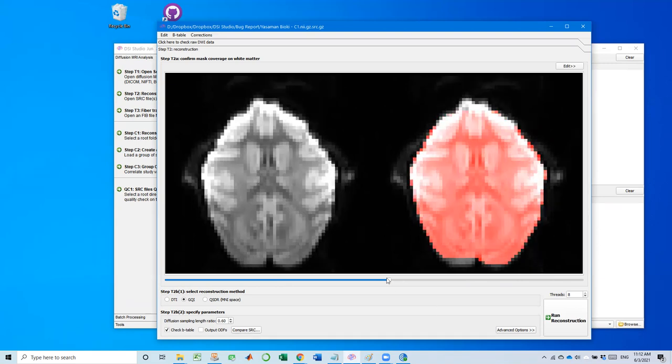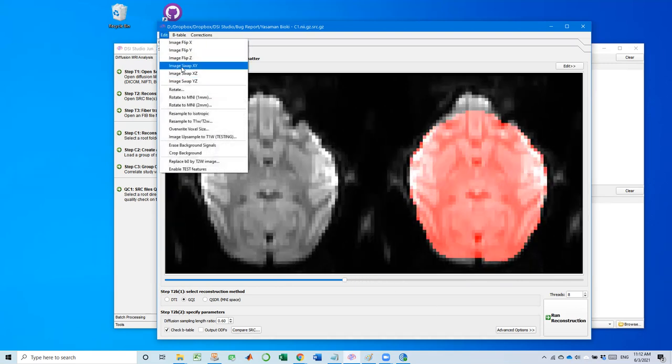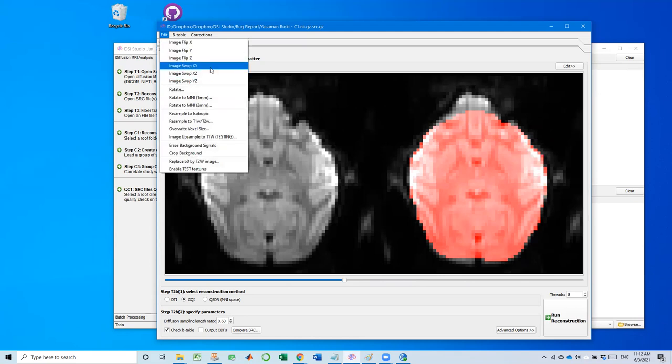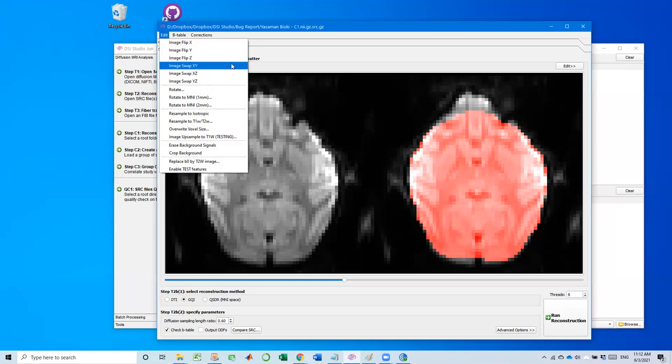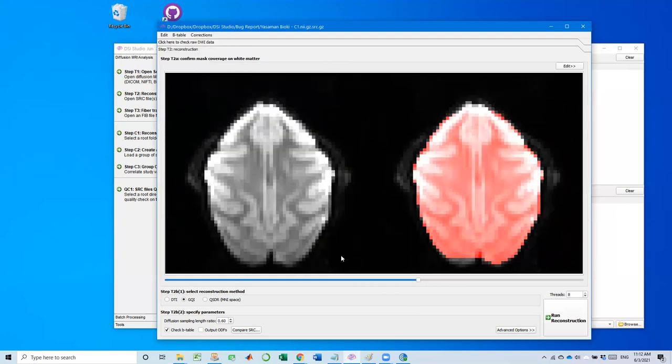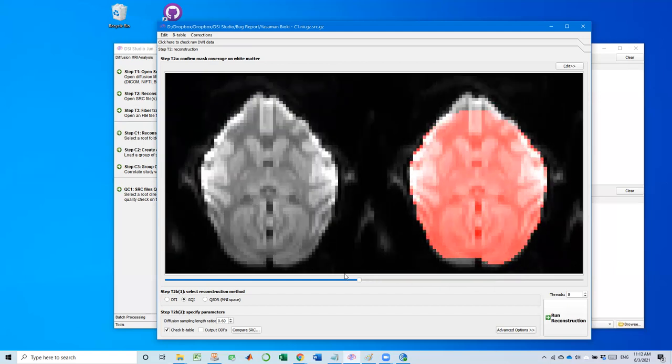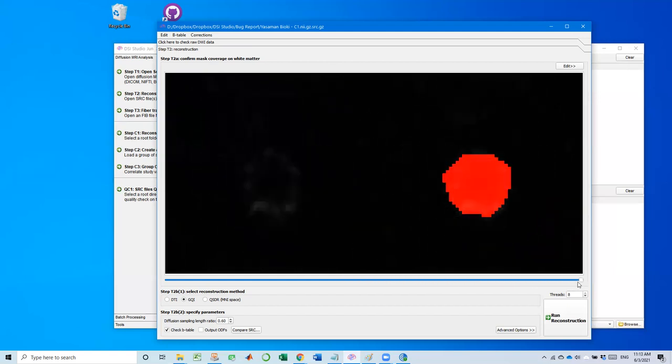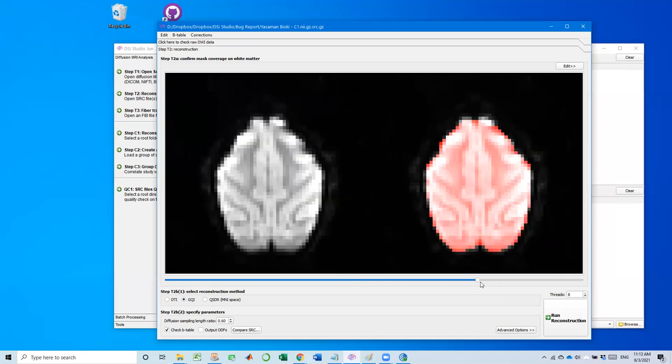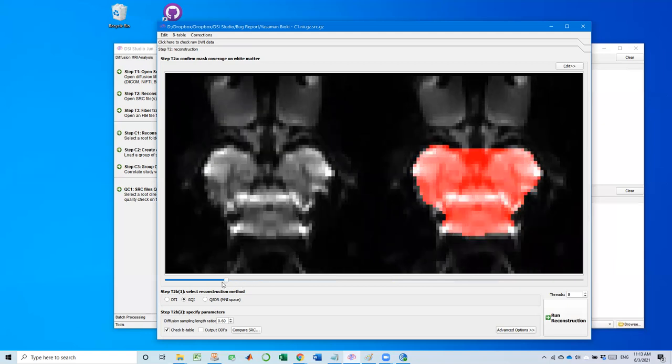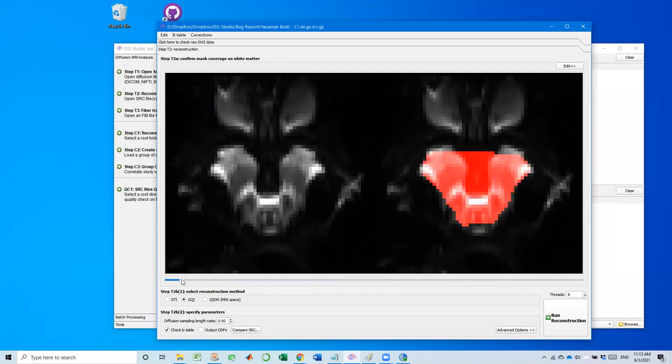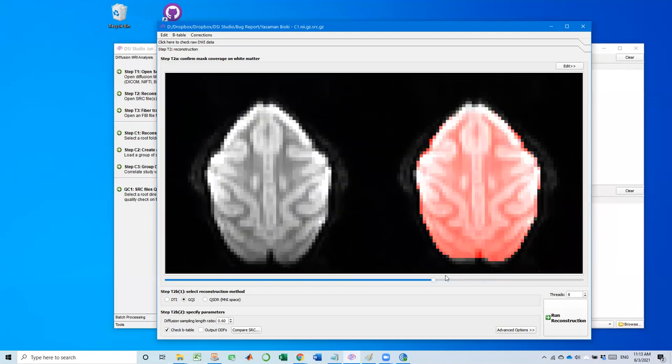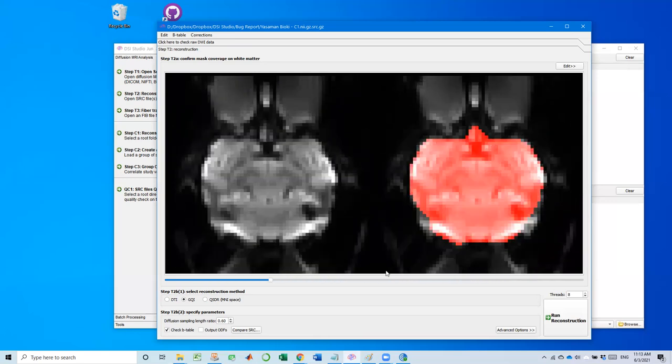So you see, just flip X and fix the mirror image. So to summarize, whenever we have a swap image dimension swap or image dimension flip, you always need to go by pair. Otherwise, you will create a mirror image that will create a problem downstream in the analysis. Also, you need to make sure that this window shows axial slides. And when you go to the right of this slider bar, you need to go to the upper part of the brain, whereas when you go to the left, then there's the bottom of the brain. So right now, this is good in terms of the image dimension.